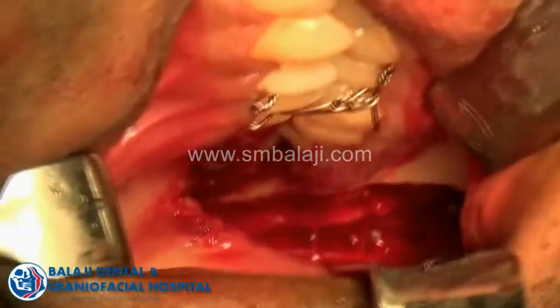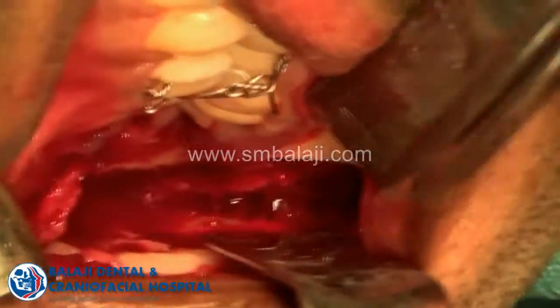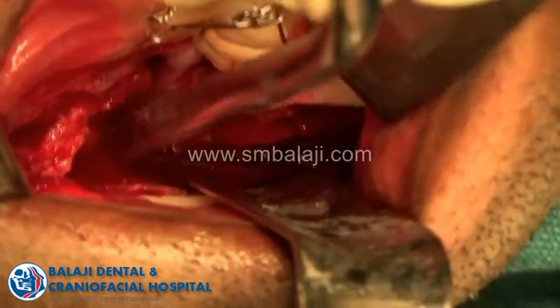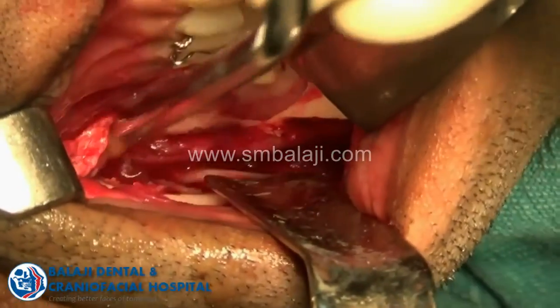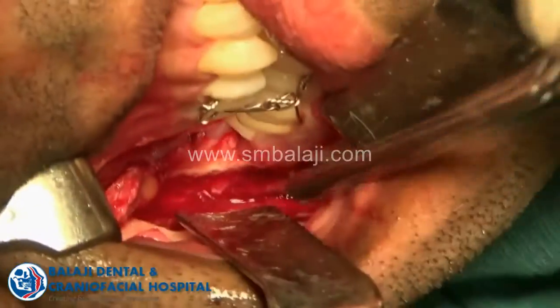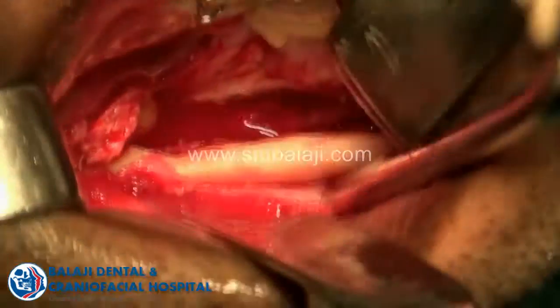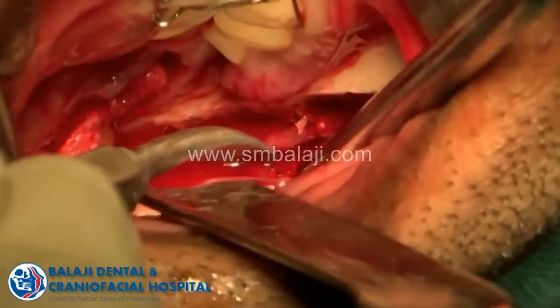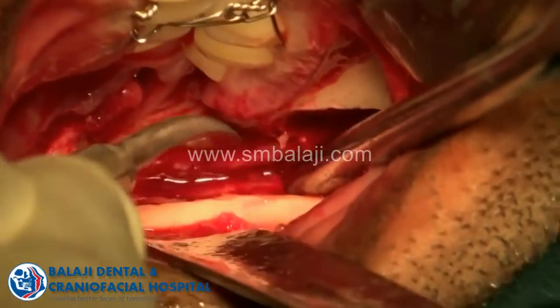You can see me moving the proximal fragment. You can see the inferior alveolar nerve clearly — it is not damaged and it is with the distal segment. This is how a good split looks: you can see the entire nerve. Whatever amount you mobilize, there will be no injury to the nerve at all. The neurovascular bundle — the vein, nerve, and artery — are not damaged, so there is absolutely no bleeding.